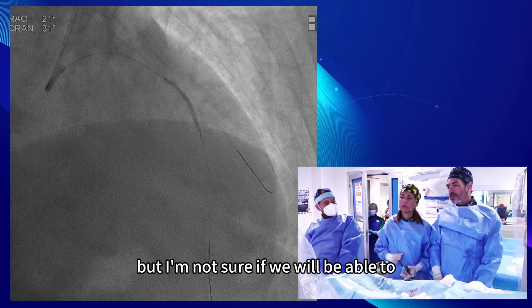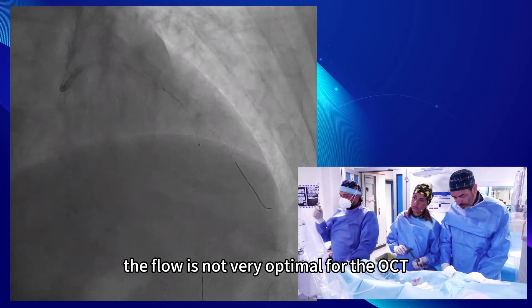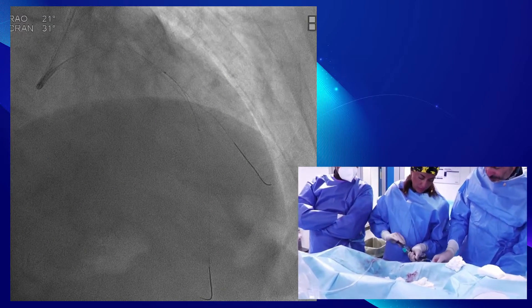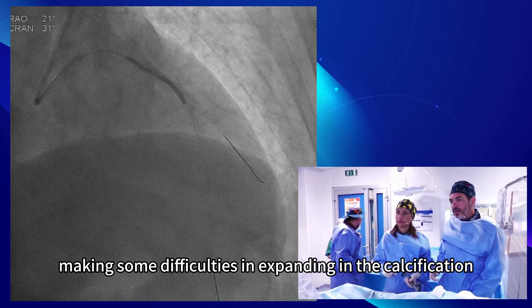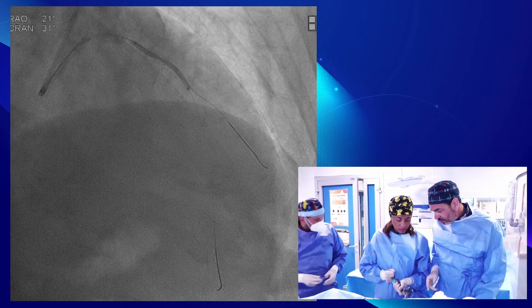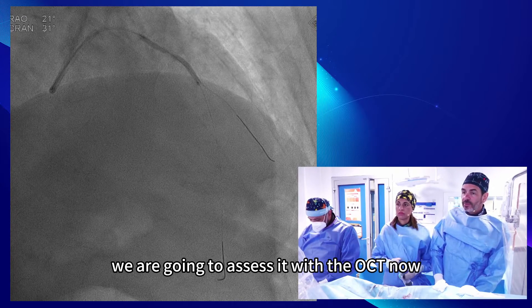The idea is to do imaging, but I'm not sure if we will be able to visualize the CTO with OCT because the flow is not very optimal. We are dealing with it again and then will decide where to do the OCT. You can see that the balloon is having some difficulty expanding in the calcification. With the Artemis we go up to 14, 15, 16, 17, 18 atmospheres. We don't want to force this too much, so we are going to assess it with OCT now.